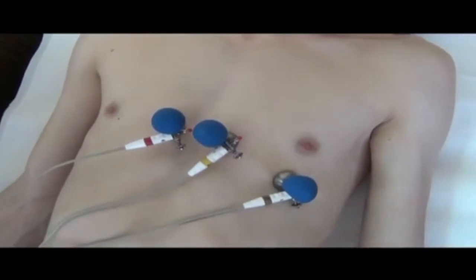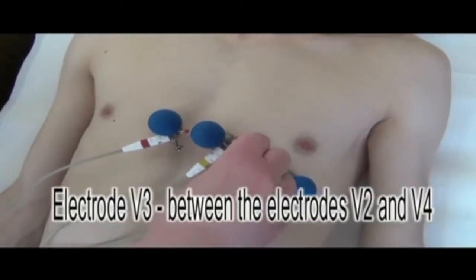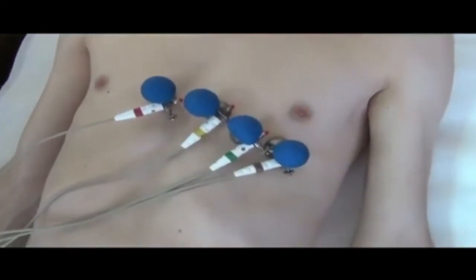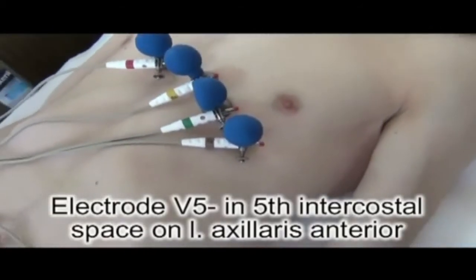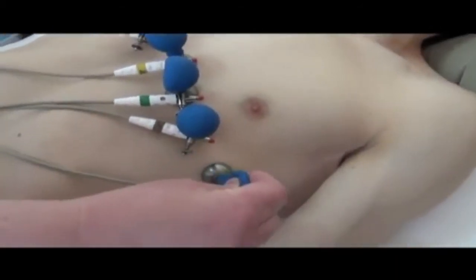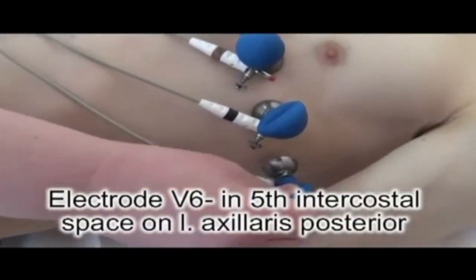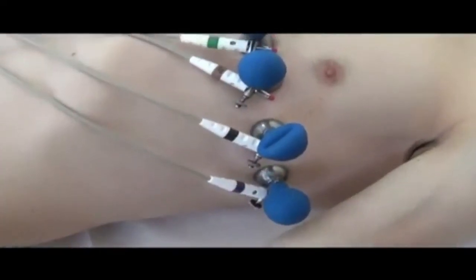After this, we fix electrode V3, which is situated between electrode V2 and V4. Electrode V5 has black color and is situated in the 5th intercostal space on the anterior axillary line. Electrode V6 is situated in the 5th intercostal space on the midaxillary line.